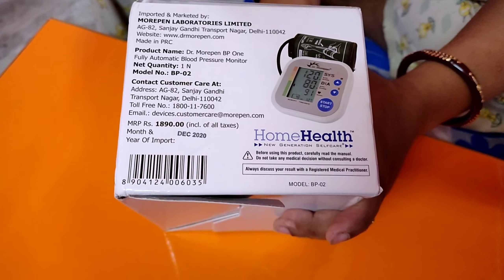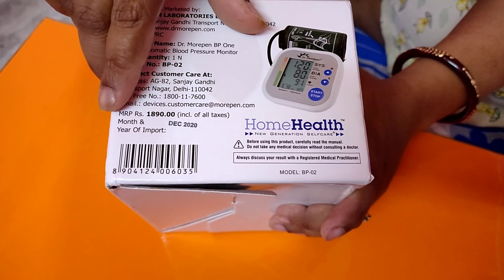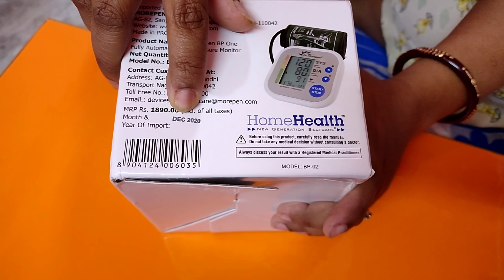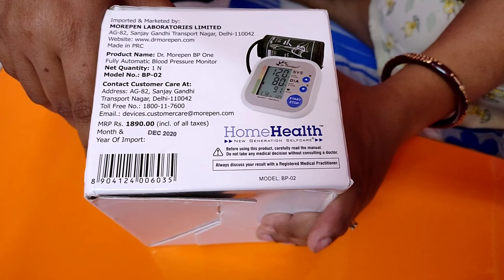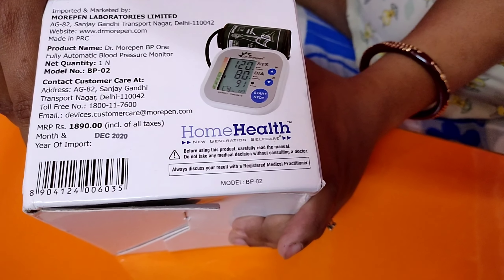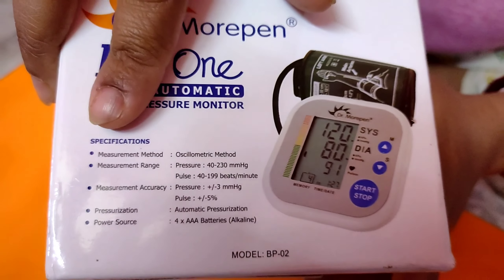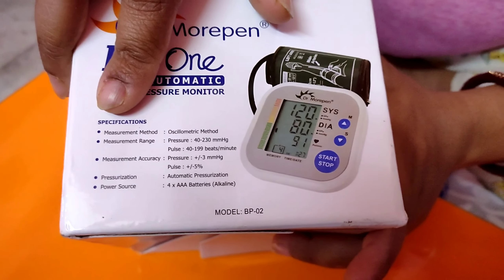This pack contains one BP monitor machine. The MRP of the product is Rs. 1890 and the month and year of import is December 2020, so it is a latest product. On the other side of the box, a detailed specification of this blood pressure monitor machine has been given.